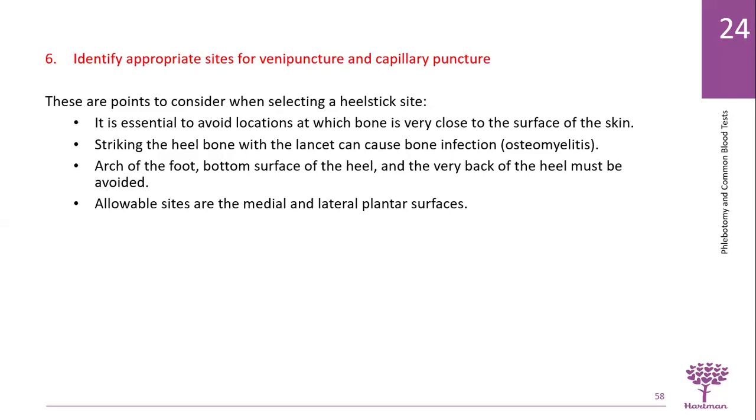The arch of the foot, bottom surface of the heel, and the very back of the heel must be avoided. Allowable sites are also the medial and lateral plantar surfaces. You need to know that as well.